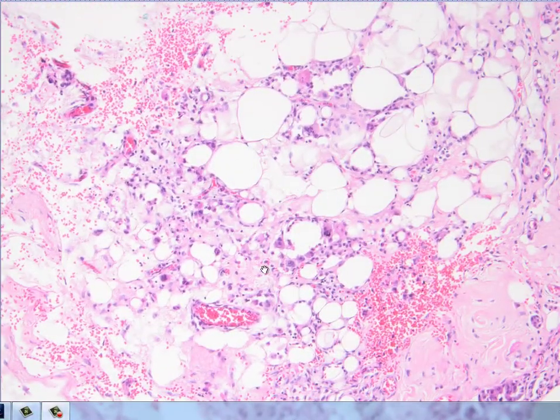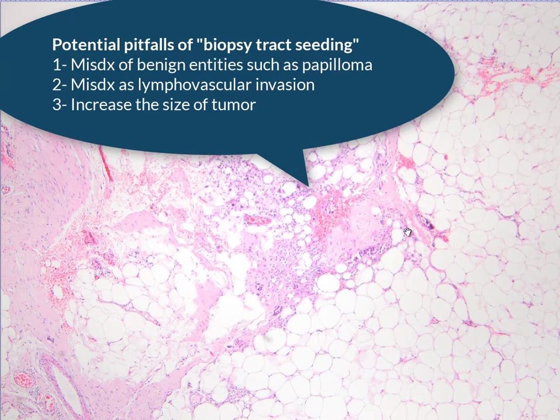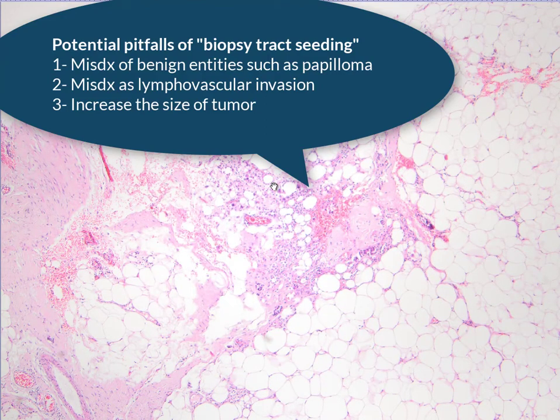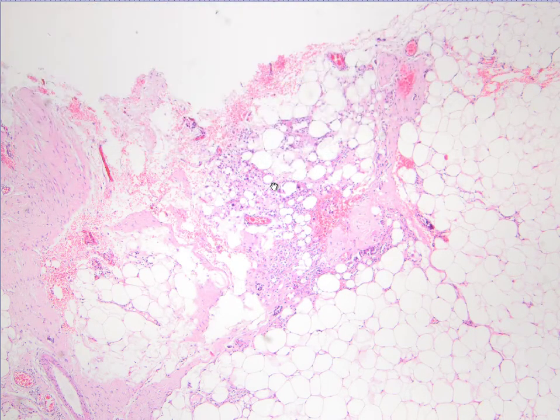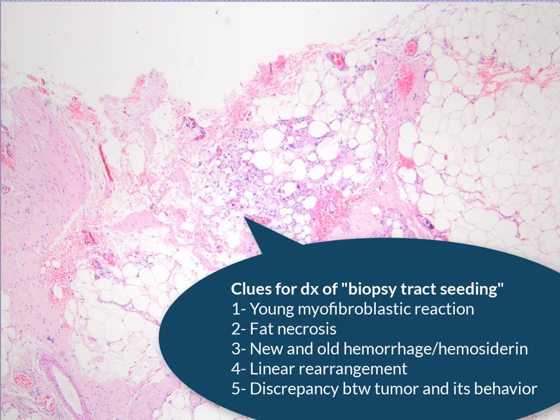Finally, I found that these tumor cells are also within the fat necrosis here. This is a very well-known phenomenon called needle tract seeding. It is important because you may falsely call this lymphovascular invasion, or you may increase the size of the tumor, which may lead to clinical consequences. It may also be seen in benign lesions such as papillomas — even lymph node seeding has been seen after needle biopsies from papillomas.